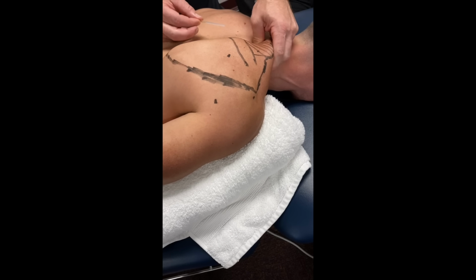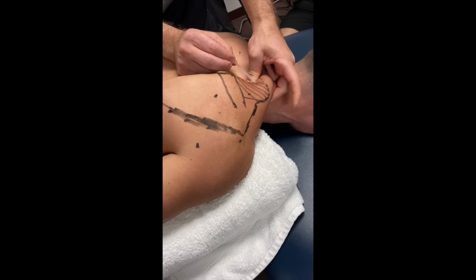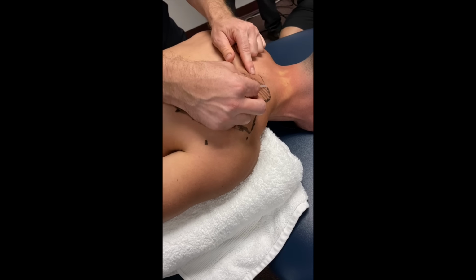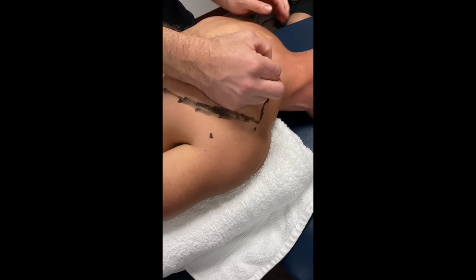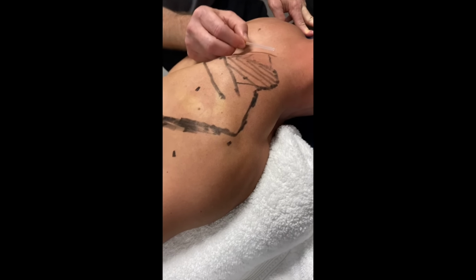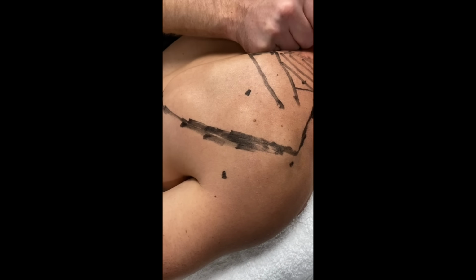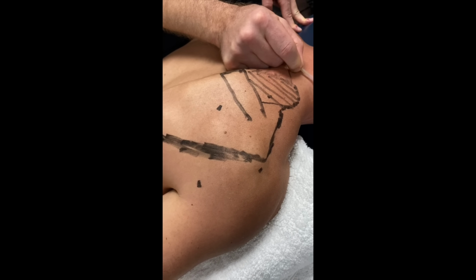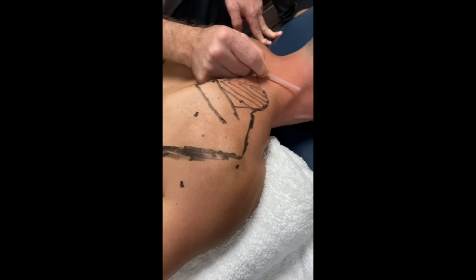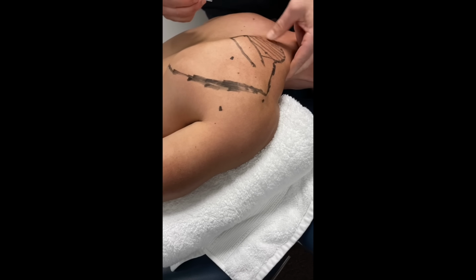The idea here is that you're gonna pull the upper trap up and away, and then you're gonna slip this needle underneath the upper trap in an effort to hit the levator as it's coming off the superior angle, right? So I wanna hit it, hit it, hit it, hit it, like this, in a fanning pattern. Clear? Let's see what we got here.